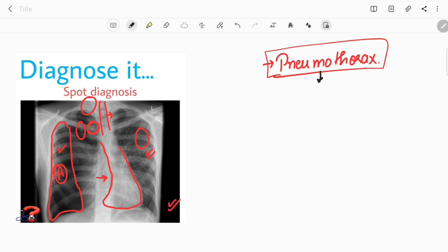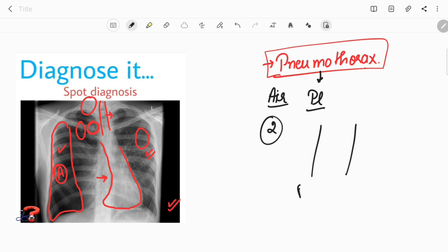Now let's discuss pneumothorax. It basically means there is air present between the two layers of pleura. Air can enter the pleural space by two mechanisms: it can enter via the parietal pleura or via the visceral pleura.